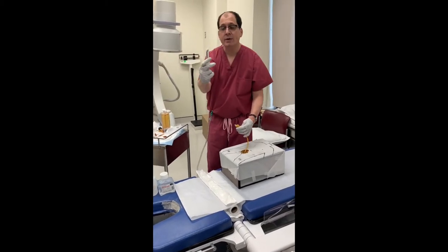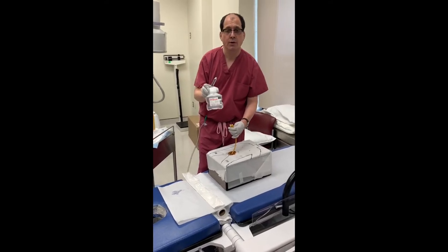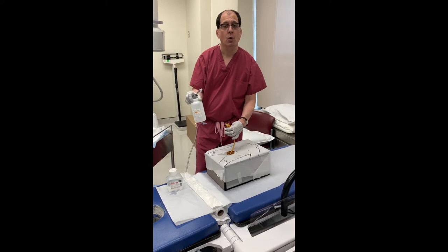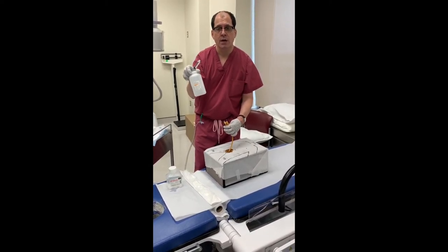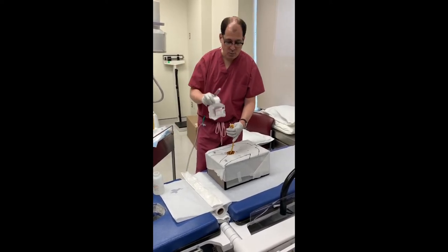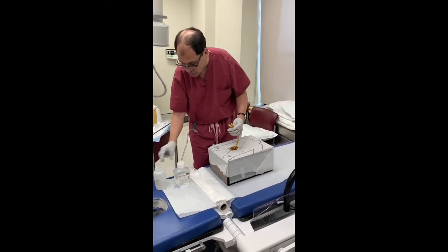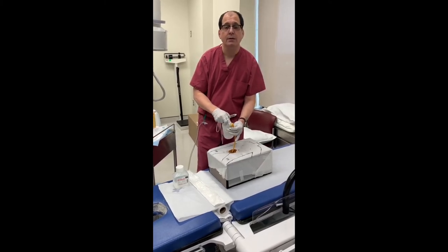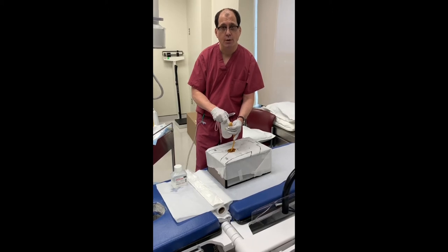You have your syringe filled with fluid. Now, this is water and this is saline — saline means salt water. Salt water can precipitate out little crystals, so it's better to fill the balloon with pure water. That way, when you deflate the balloon, it'll be easy the next time. If you use salt water, the salt may clog the tube and you'll have difficulty taking it out. So always use water if you can.